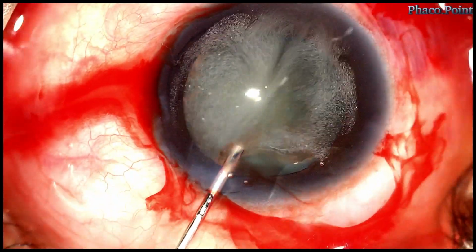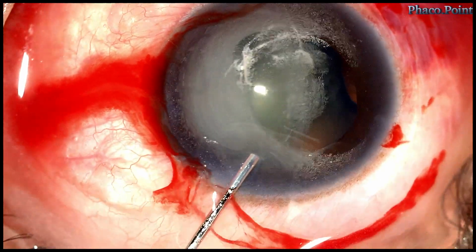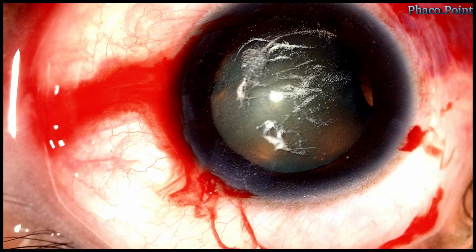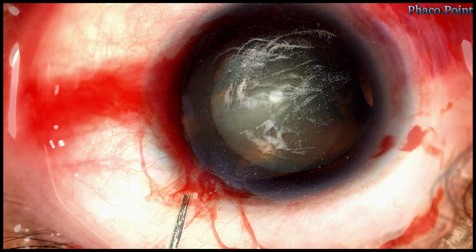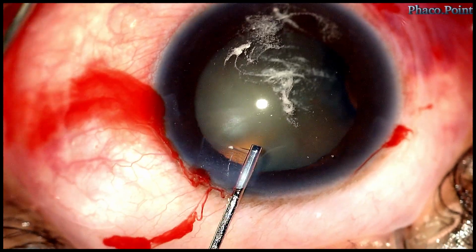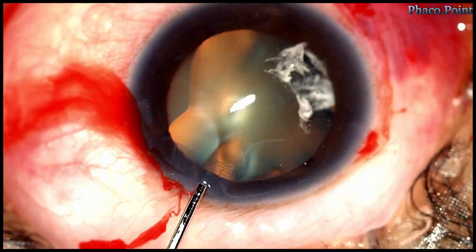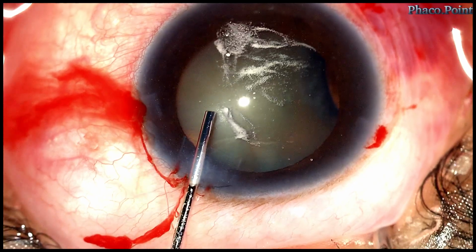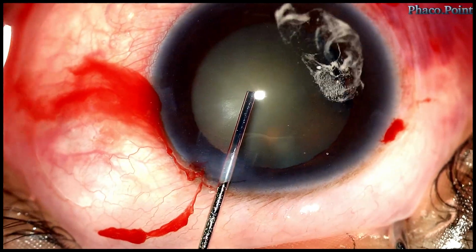Next, I introduce some diluted triamcinolone in the anterior chamber to look for any disturbed vitreous. And as you can see, it's clearly obvious now that there is a significant disturbance of vitreous which has prolapsed into the anterior chamber. Upon washing out the triamcinolone from the anterior chamber, I notice that the vitreous actually goes back via the zonular dialysis into the posterior segment.